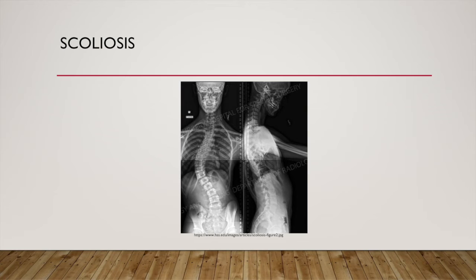Because the exposure is taken of the entire spine and there are variations in thickness from the C-spine to L-spine, compensating filters may be used. And they are used at UNC CP2 Ortho, UNC Ambulatory Care Center, as well as UNC Imaging Center. And for shielding, breast shields and gonadal shields are used. And you have two 14 by 17 inch digital IRs that can be interlocked in a 14 by 34 inch plate. And basically the imaging software stitches or merges the two images together and makes one complete image appear on the monitor.